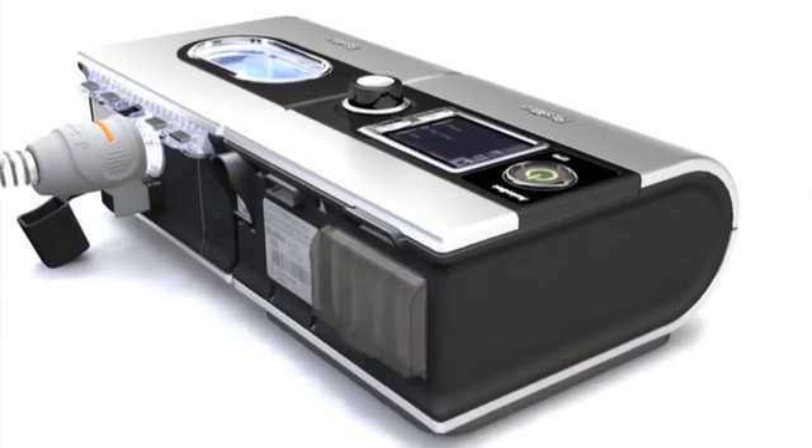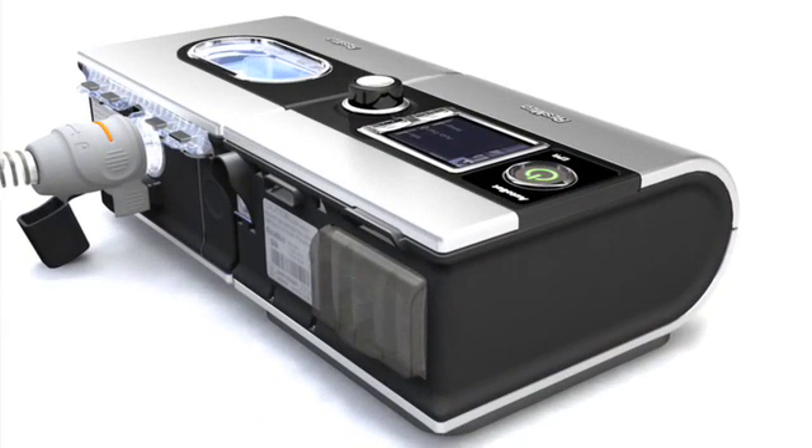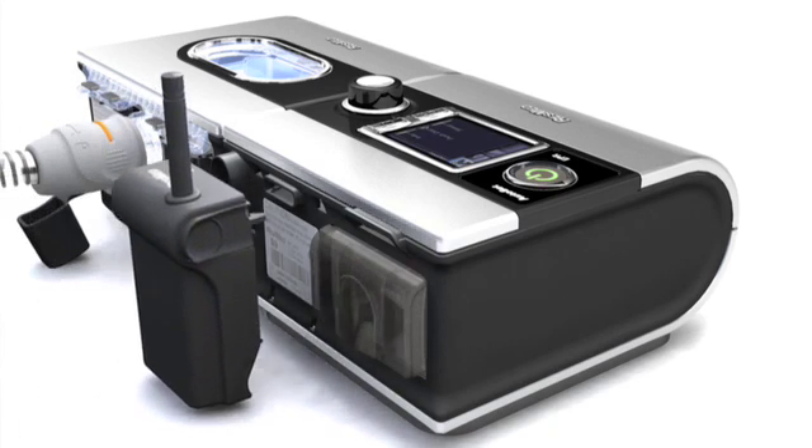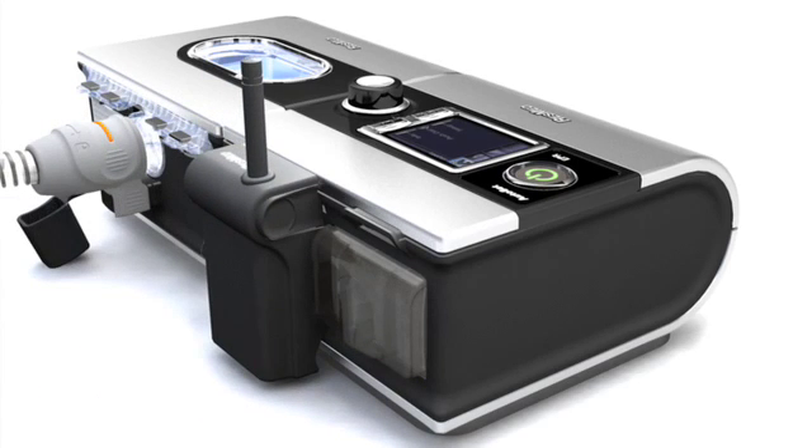The S9 offers a whole new range of options for getting the data back to our customers, and the S9 helps our customers do that by providing multiple options. They can get data back wirelessly through our GSM wireless module, much like they do today with the ResTrax.